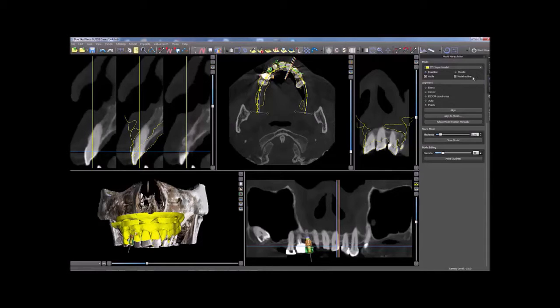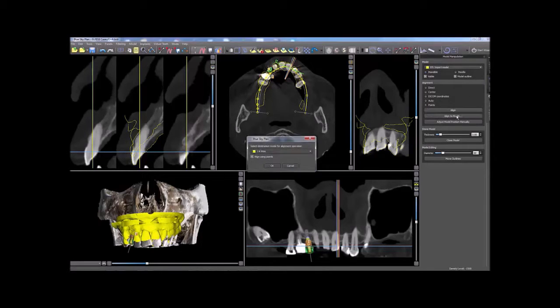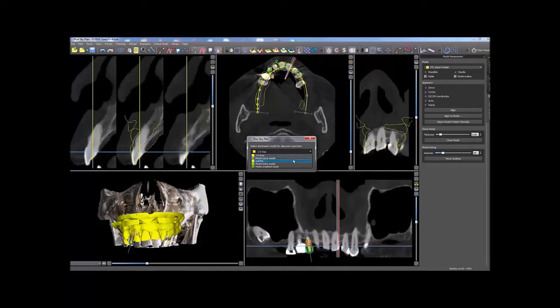Then click the Align to Model button. In the Select Destination Model dialog, choose the model that is currently aligned to the CT scan. Click the Align Using Points checkbox if not previously selected, then click OK.